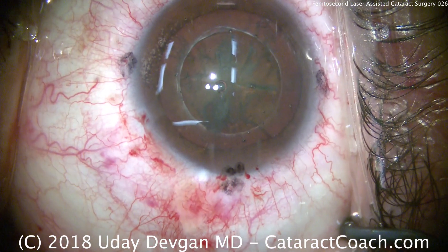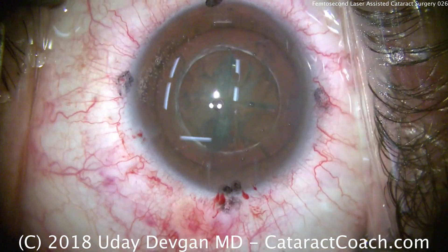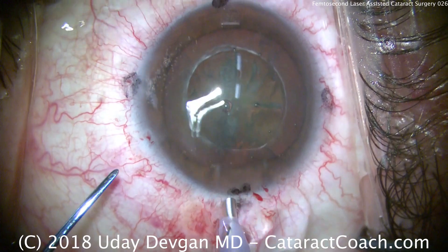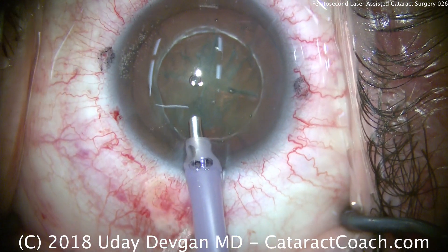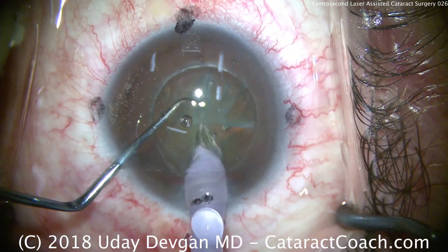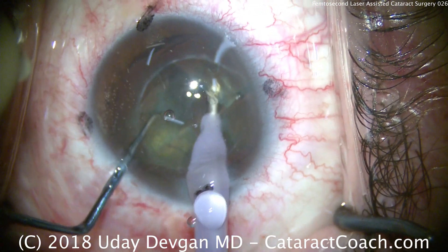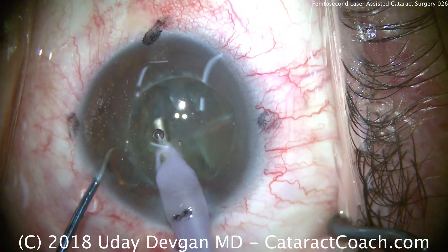We'll put the phaco probe in the eye and simply separate the pieces. The phaco probe goes in on a quadrant removal type setting — higher flow, higher vacuum — and we don't need much ultrasound energy in this case. We're using the instruments to mechanically separate the pieces without even needing the vacuum.